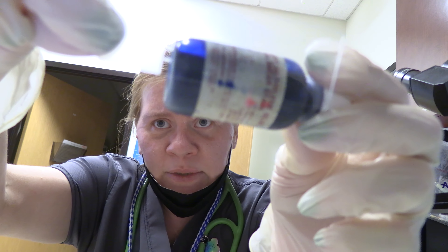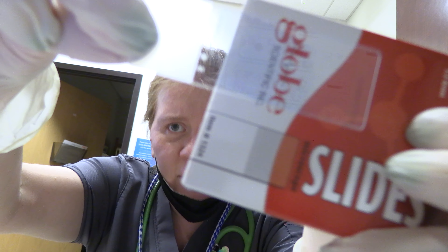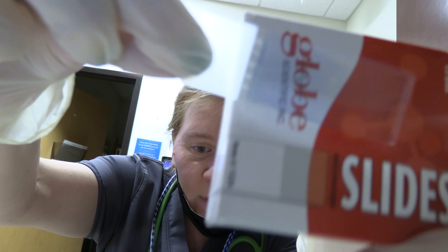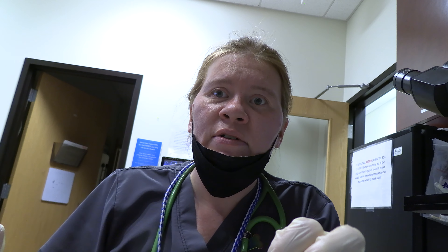Got a nice little feathered edge on this one. A nice feathered edge is what you want. Now we'll let that sit and dry for about 10 minutes, and then we'll go examine our slide.